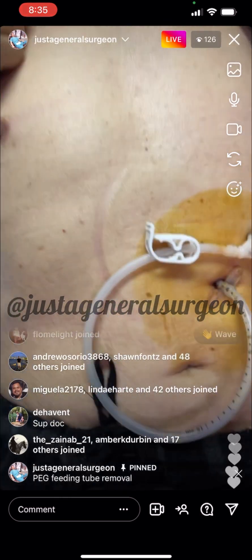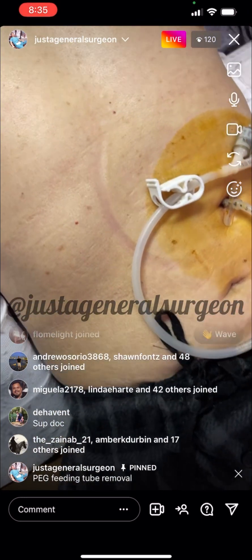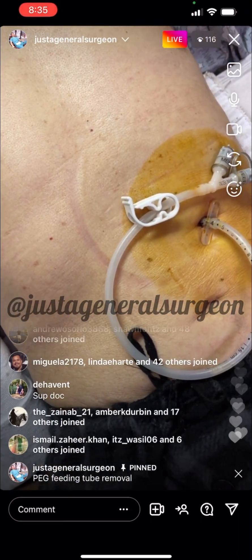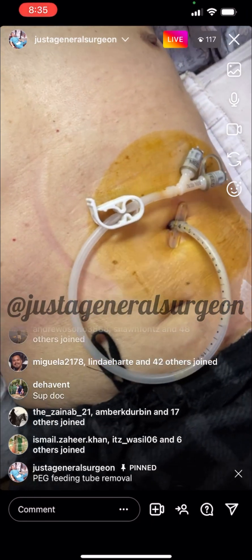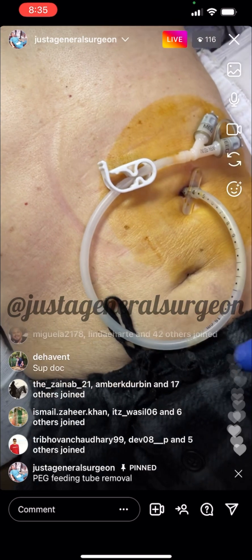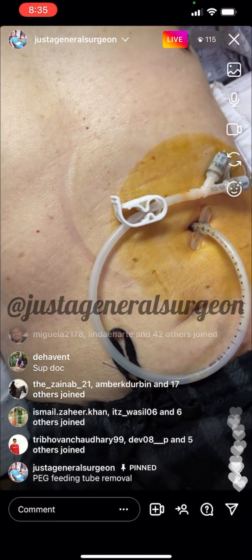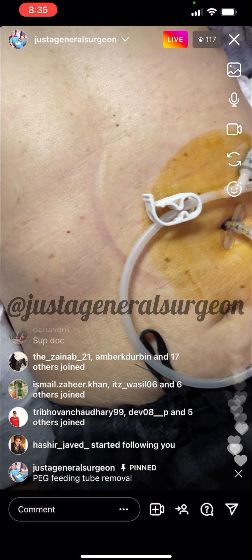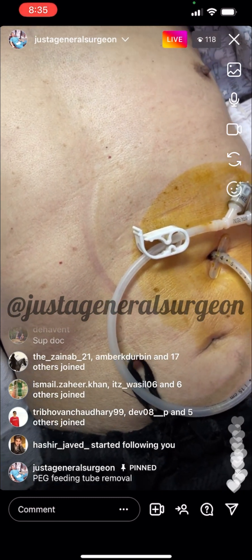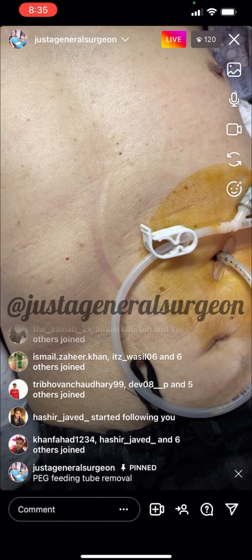This is an elderly gentleman who suffered a stroke earlier this year. He was hospitalized and on a ventilator, so obviously he couldn't eat for himself. For enteral nutrition, he had a feeding tube placed — this is a PEG tube, placed by the GI doctor. He has thankfully recovered enough from the stroke where he can eat by himself now, take his medications by mouth, and maintain his weight normally.